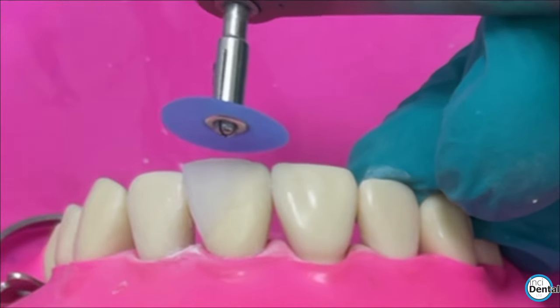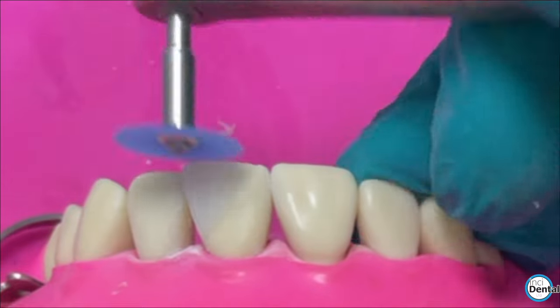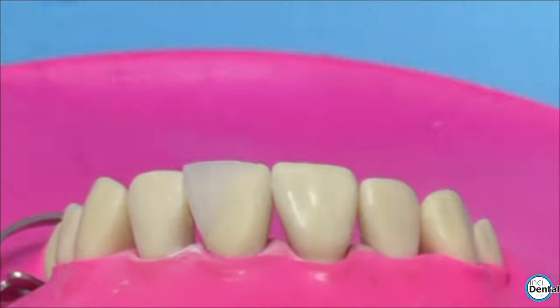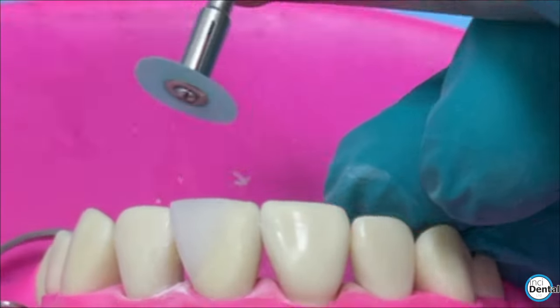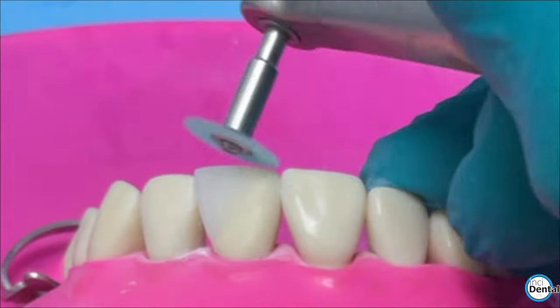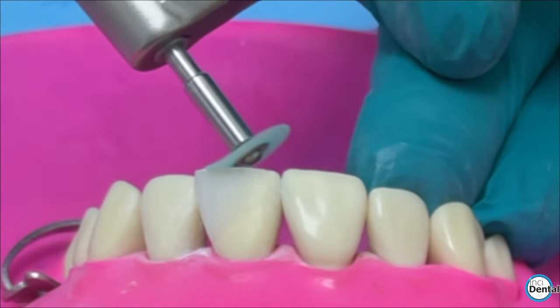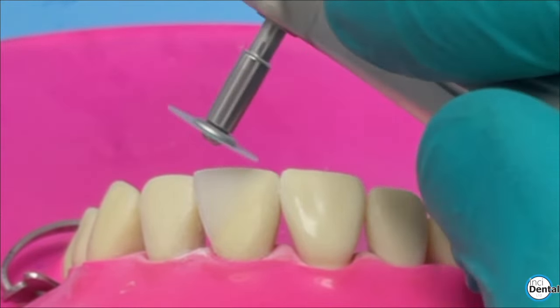Now I've moved on to the incisal edge. It's best to do this with the patient sat up, looking straight at them, so you've got the best chance of getting the incisal plane correct. I've gone to a slightly smaller 12 millimetre disc with the course, and then to the 10 millimetre — the smaller contouring disc — so I can get in with a little more control and just get that incisal edge levelled off.